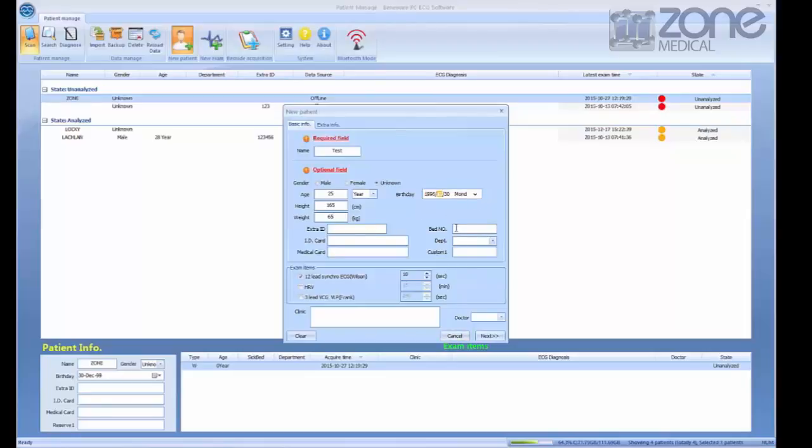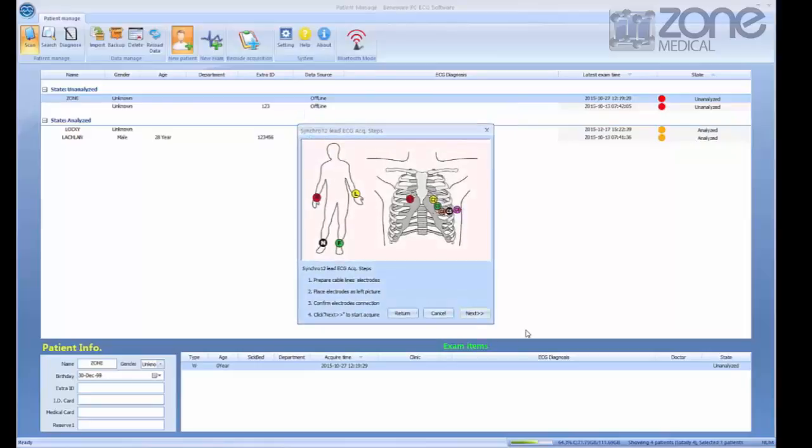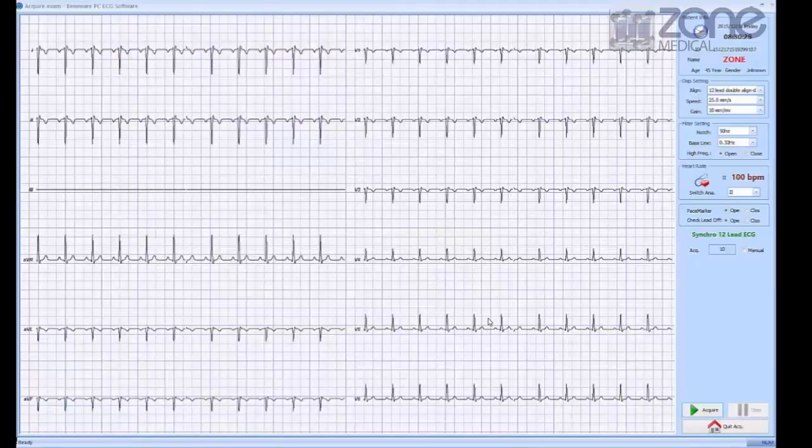Once you're finished, select next. A pop-up will appear with the correct ECG electrode placement before you're taken to the results.